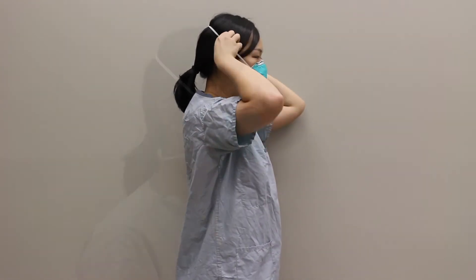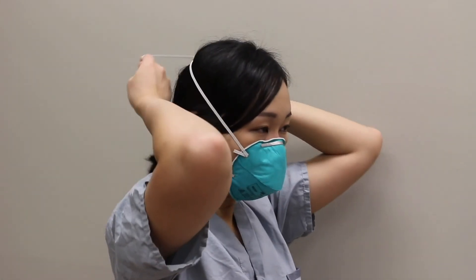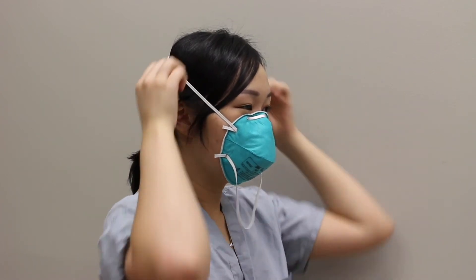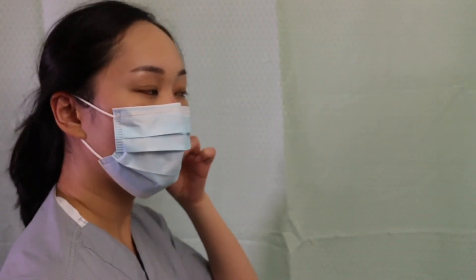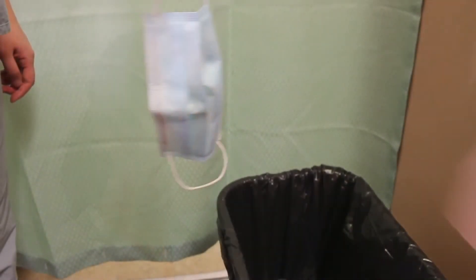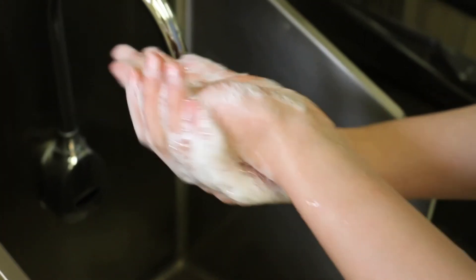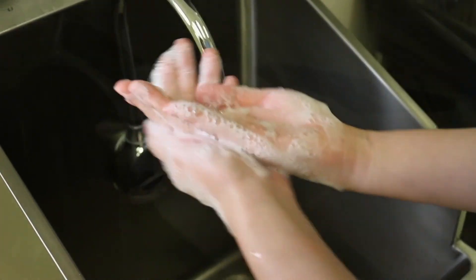Ties, ear loops and straps are considered to be clean and may be touched with the hands. The front of the mask or respirator is considered to be contaminated. Untie bottom tie, then top tie, or grasp straps or ear loops. Pull forward off the head, bending forward to allow the mask or the respirator to fall away from the face. Discard into waste receptacle or into appropriate container to be sent for reprocessing. Do hand hygiene.